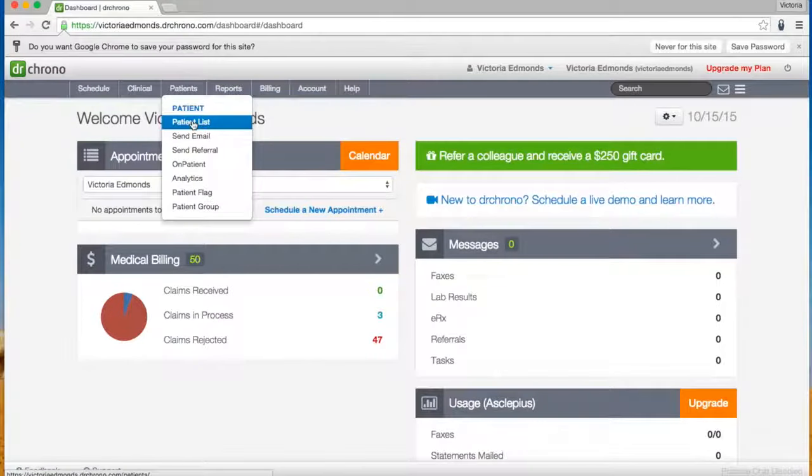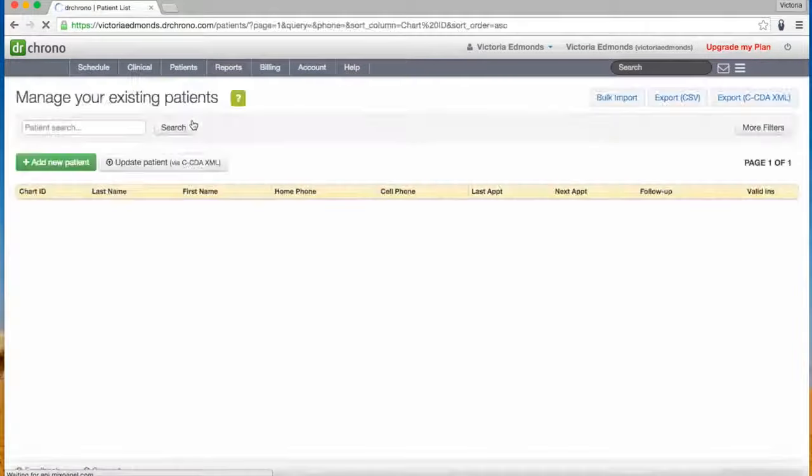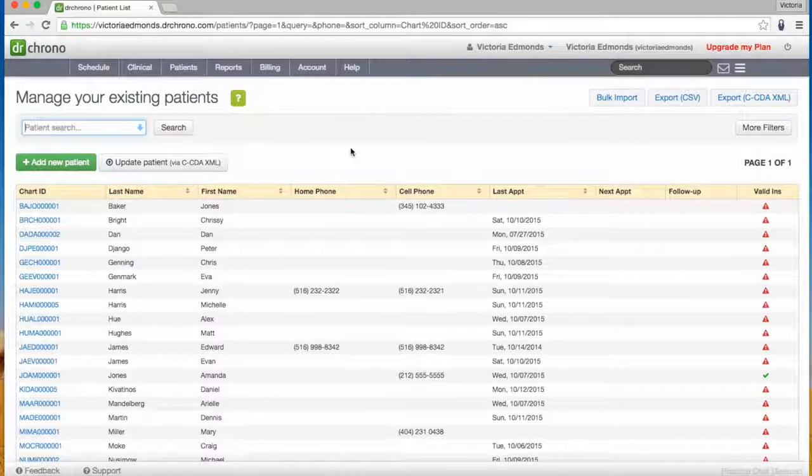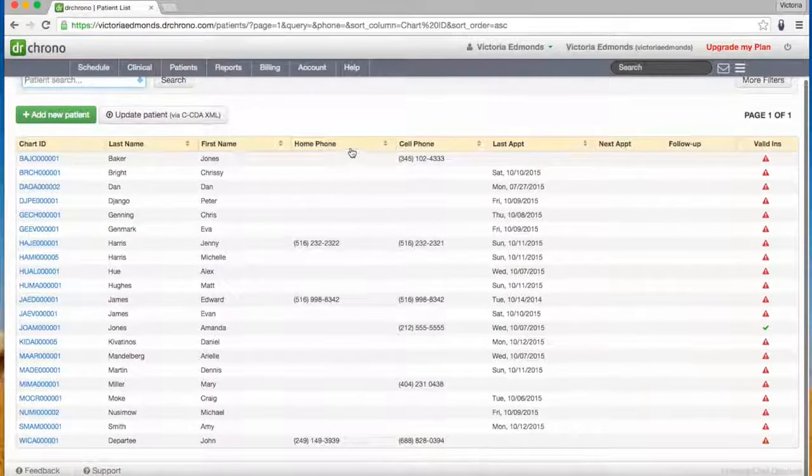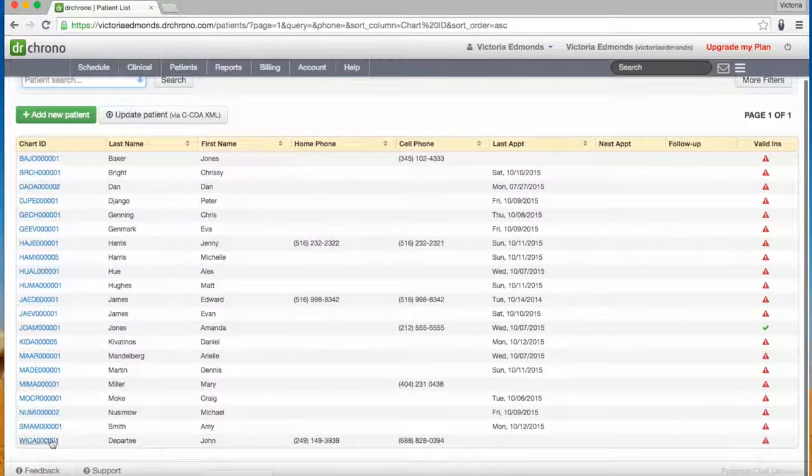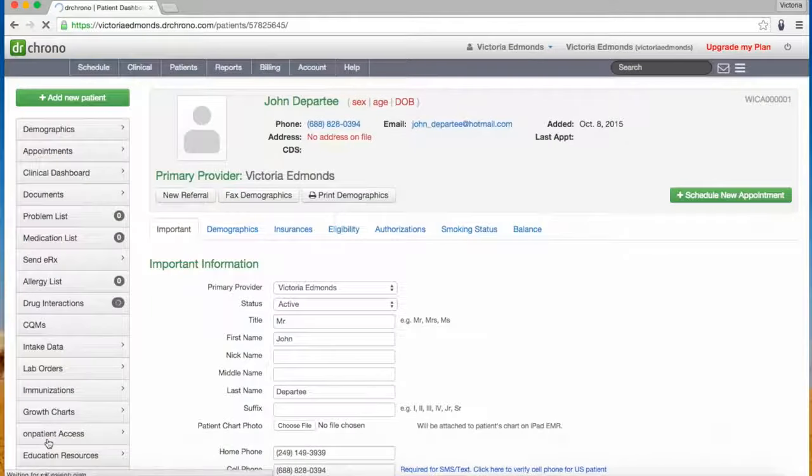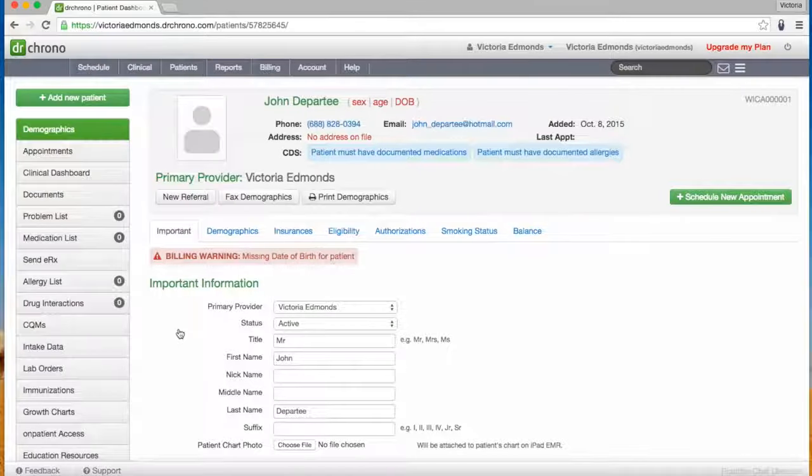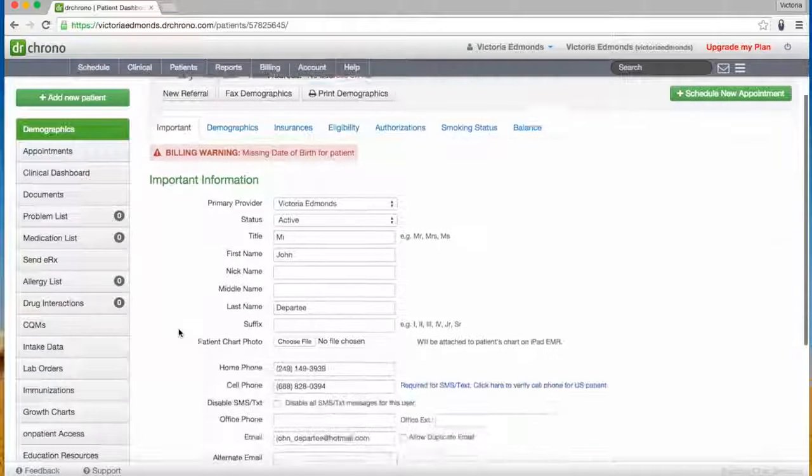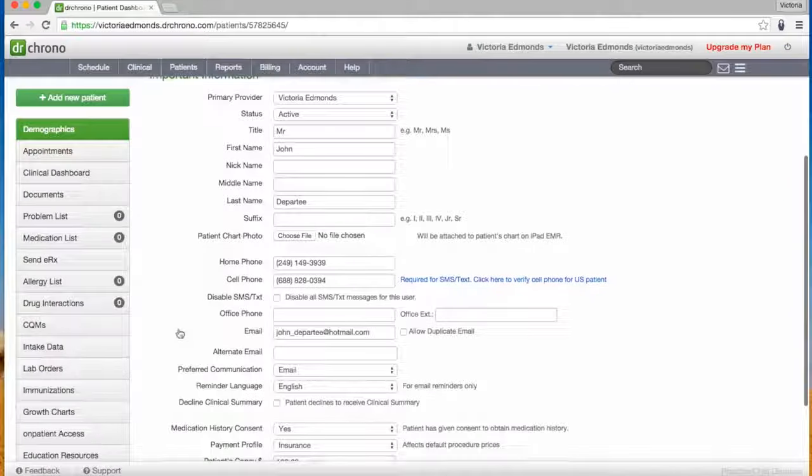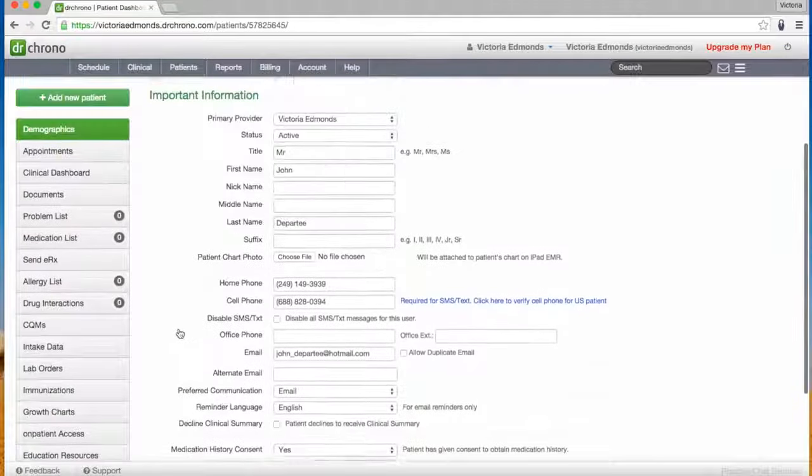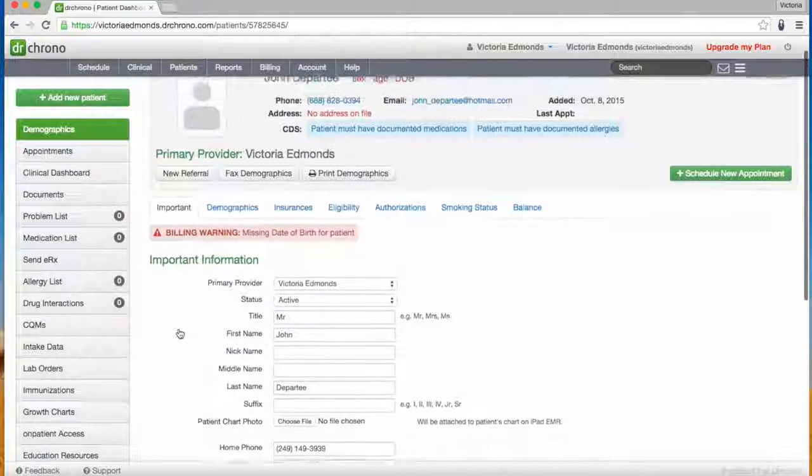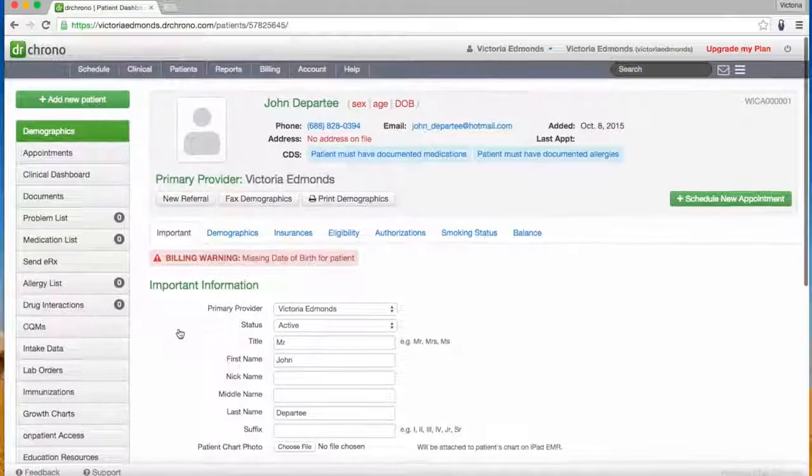From here, navigate to your patient list and select the patient whose file you would like to view. This is where your patient's demographic information is saved.